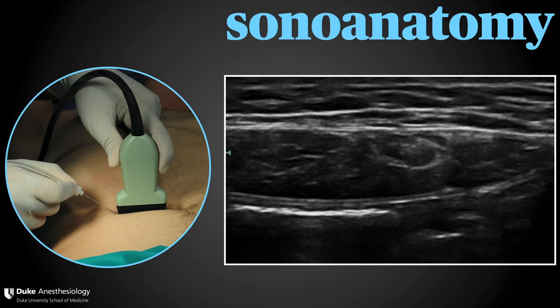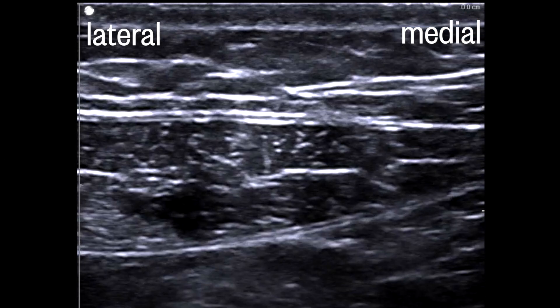Here's what you're going to be looking for: a lens- or feather-shaped muscle encircled by bright hyperechoic fascia. You want to see the characteristic train tracks, or double white lines, of the posterior rectus sheath — that's your target. You can appreciate the bright line below the sheath, which is the peritoneum.